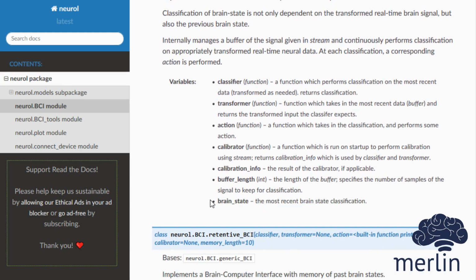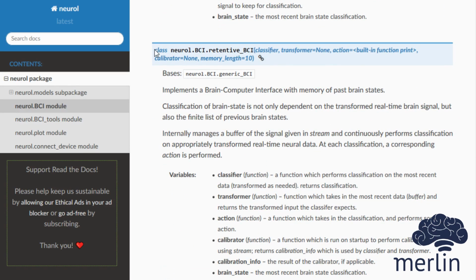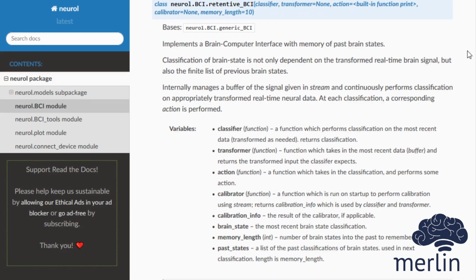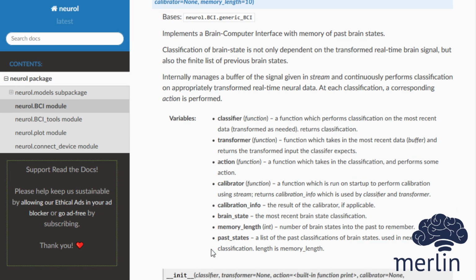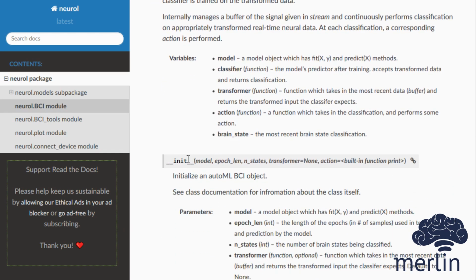brain states. Taking that a step further, we have retentive BCI, which implements a BCI with memory of past brain states so that classification can depend on the history of previous brain states, up to some memory length. And finally, there's AutoML BCI, which builds its own classifier by training a machine learning model in a calibration stage. We'll talk more about AutoML BCI when we demonstrate Neurol in action.